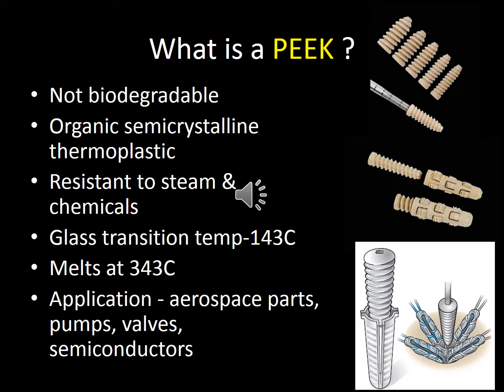It offers the advantage of good stable fixation and ease of post-operative imaging while not having any complication associated with polymer degradation. It is also used in aerospace parts, pumps, valves and semiconductors. Commercially, it is also available with a sheath so that the screw can be placed in the center of the graft without lacerating the soft tissue strands.